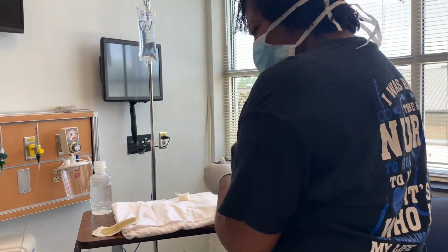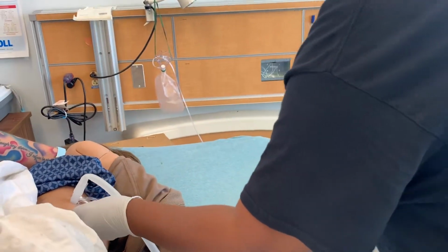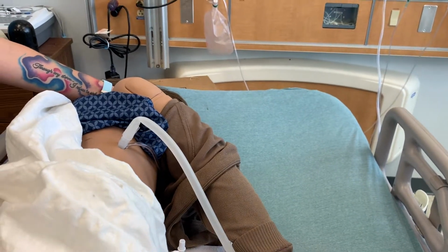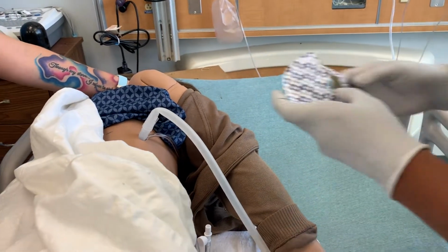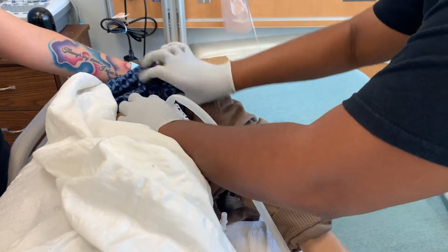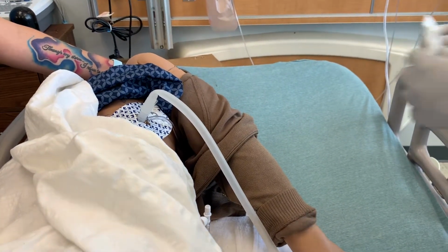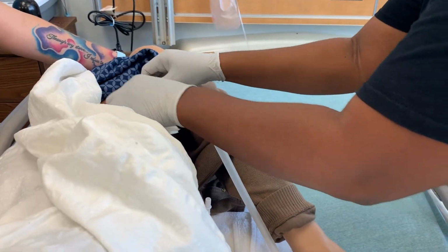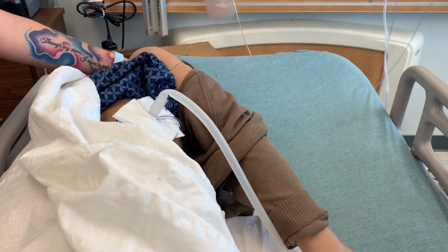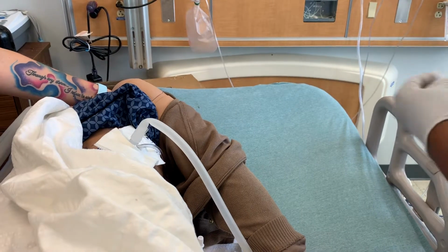Next, clean the site with antiseptic using an inside to outside technique. Place the chest seal around the chest tube and cover with 4x4 pads, ensuring to tape all 4 sides of the 4x4 to secure them to the patient.